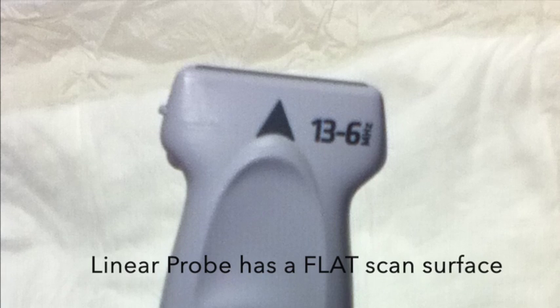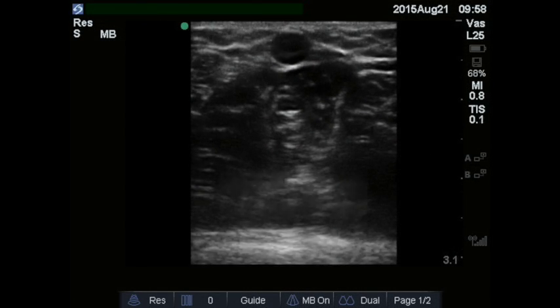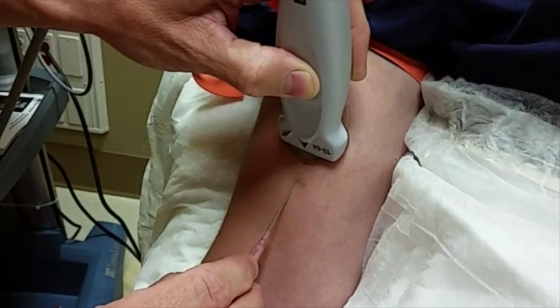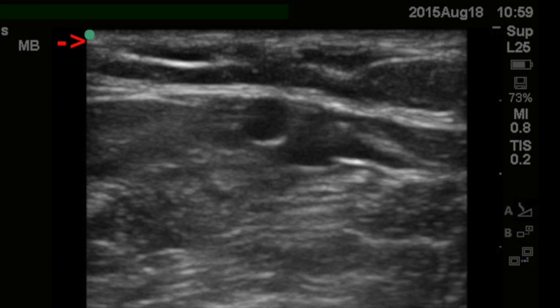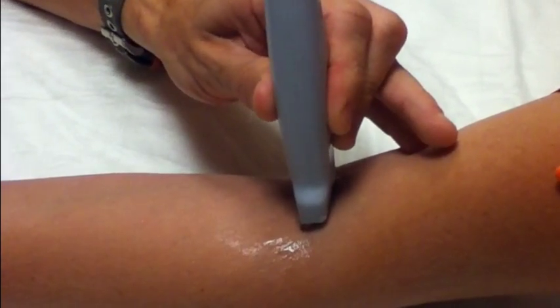On the ultrasound machine, use the linear probe. The only adjustments you may need to make are depth and gain. Depth controls the depth of the image; gain controls the brightness. Generally, the image will show a number indicating total depth — in this case, 4.3 centimeters. Be sure the probe is oriented so that your left side correlates with the left on the probe and the left on the screen. You want to confirm that when you move your needle left, it moves left on the screen as well. There is a marker on the probe that correlates with a dot on the screen. If you're unsure, put a bit of ultrasound gel on one side of the probe and watch it on the screen, or just touch one side with your finger while watching the screen.